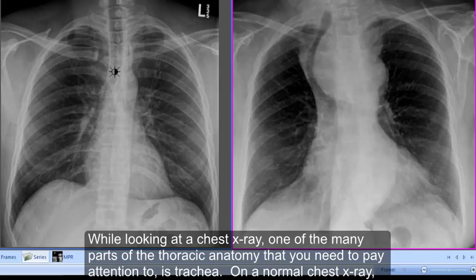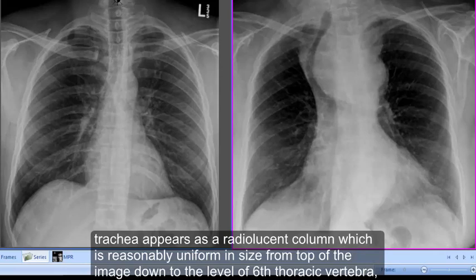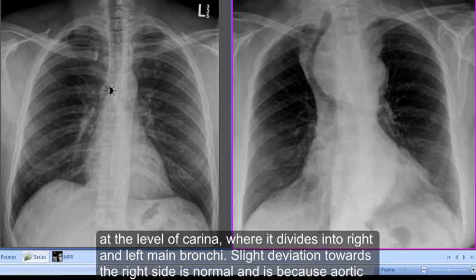On a normal chest x-ray, the trachea appears as a radiolucent column which is reasonably uniform in size from the top of the image down to the level of the sixth thoracic vertebra, at the level of the carina where it divides into the right and left main bronchi.